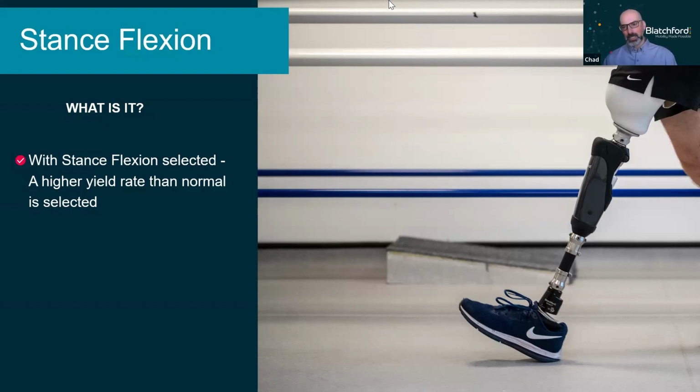So think about our K2 patients as they're going down a slope, a gradual slope or something, or even for that matter, you're walking in a parking lot and their heel comes down on a little bit of a pebble or a little bit of a raised crack in the parking lot, right? That can cause a rapid flexion moment like that. And the knee recognizes that and it's going to ramp up resistance right away, giving even more control and more support.